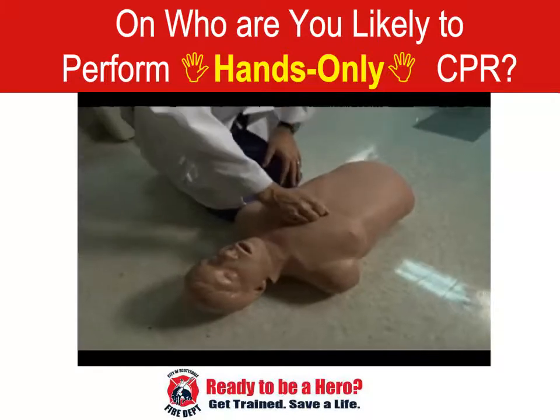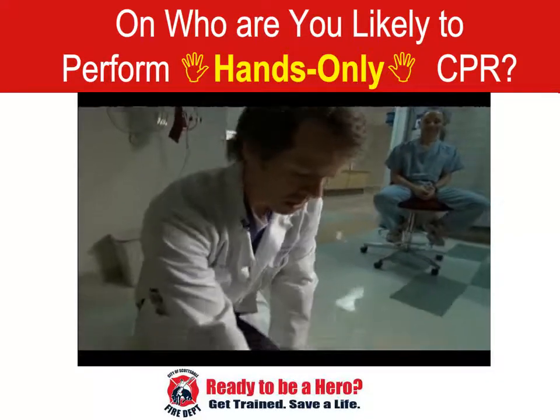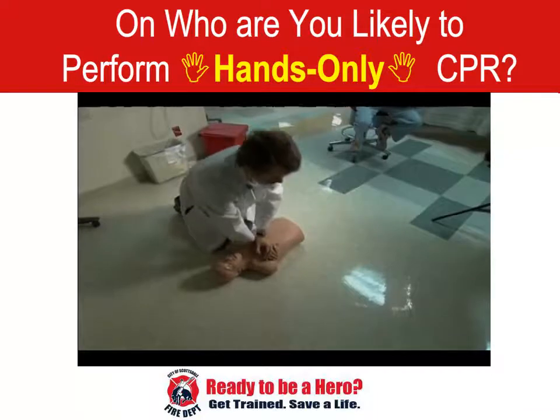Mr. Jones, are you okay? Are you okay? Dr. Tyler Vetabancourt and his colleague Dr. Bentley Bobrow are using this mannequin to demonstrate an updated version of CPR called Continuous Chest Compression CPR.